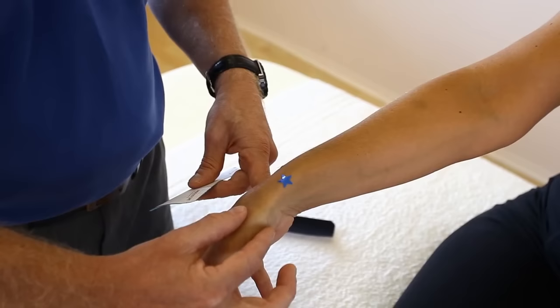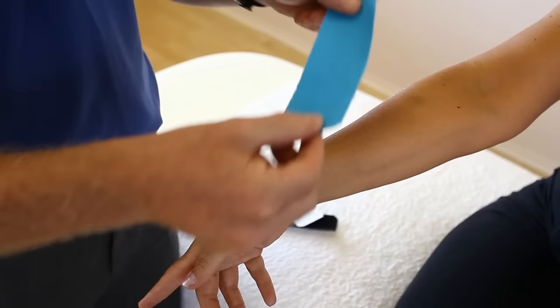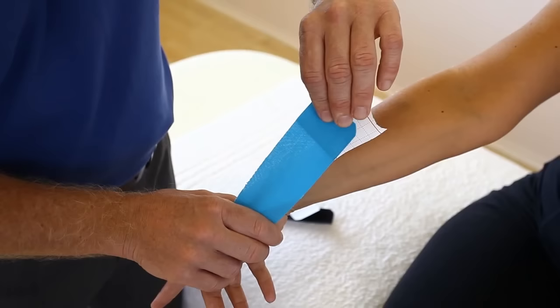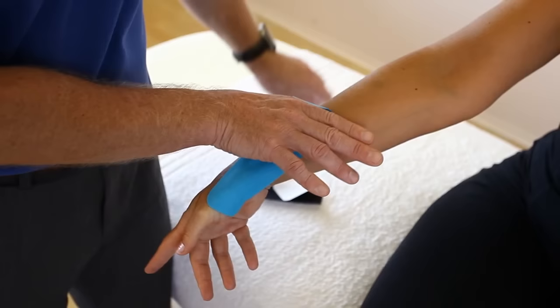We're going to split the tape — just rip and tear it — and then apply the first part with no stretch onto the base of the thumb like so. Then just peel that back, hold onto the opposite end, and apply a little bit of stretch. So if a hundred percent stretch is maximum, you only want fifty, twenty-five, or just ten to fifteen percent. Lay it down because the stretch is coming from the actual tissue from the patient stretching it.